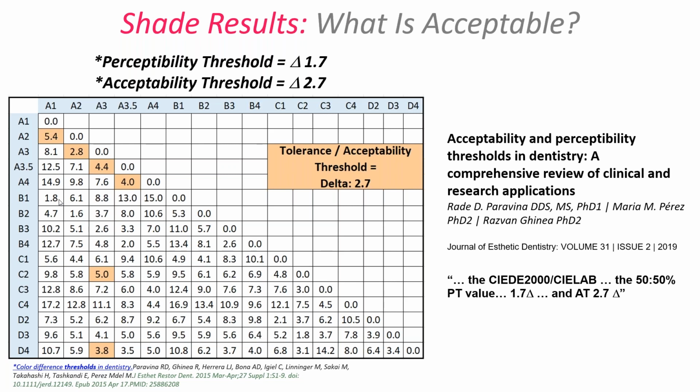different eyes looking at the same patient under different lighting conditions, different angles, holding the shade guide a different distance from the patient's mouth, a lot of these can be interchanged, and maybe you've got a better choice of shade if you get rid of the thought in your mind that A2 is a solve-everything shade.